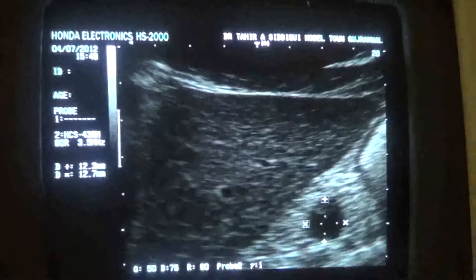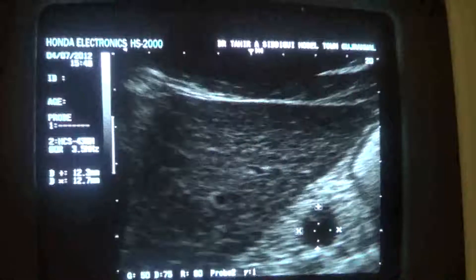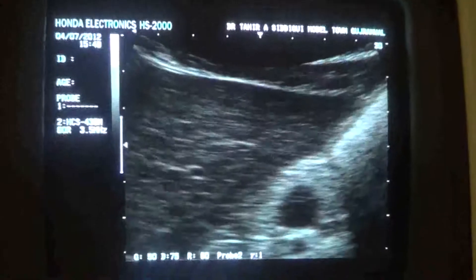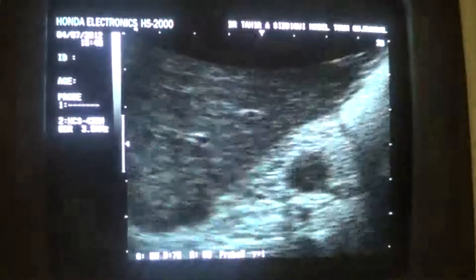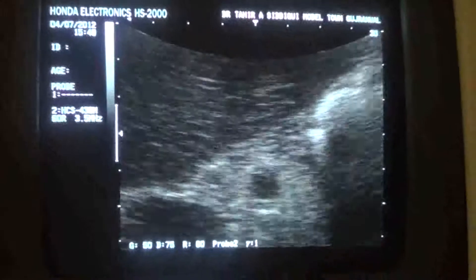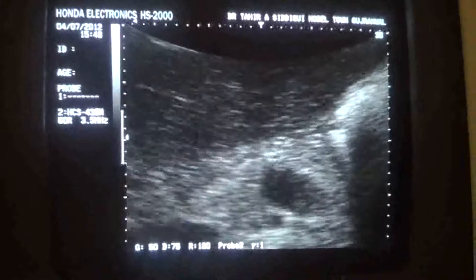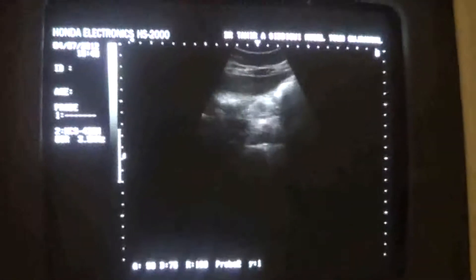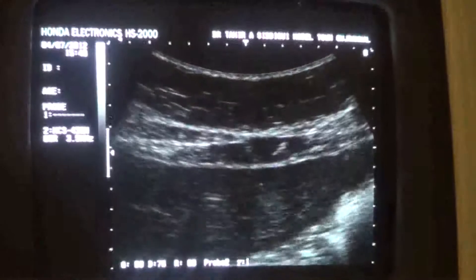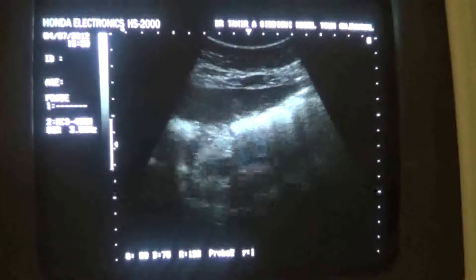Keeping the postural anatomy in view, I have now magnified the pancreas. I am going transverse now — I have moved the transducer transversely in the epigastric region.